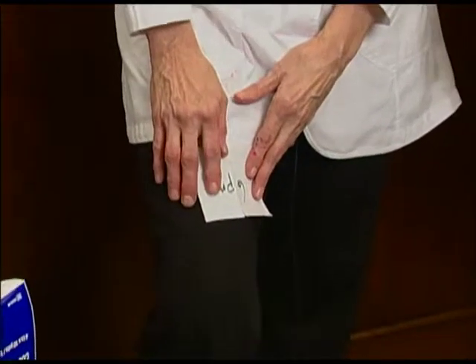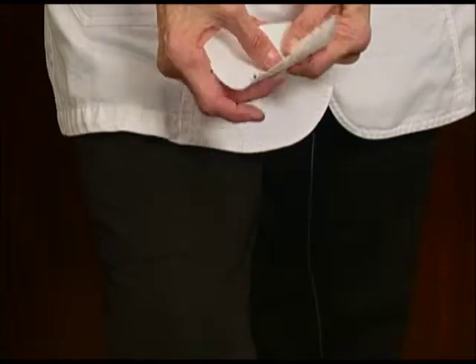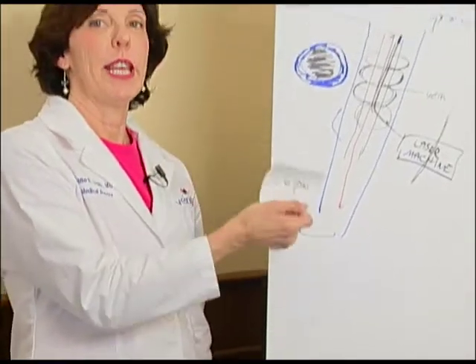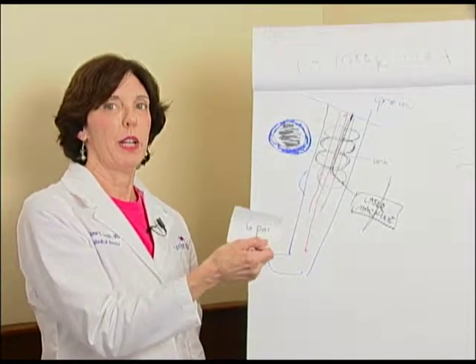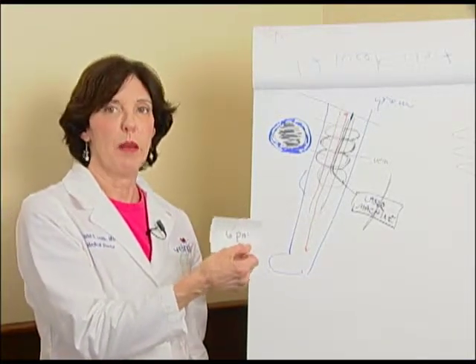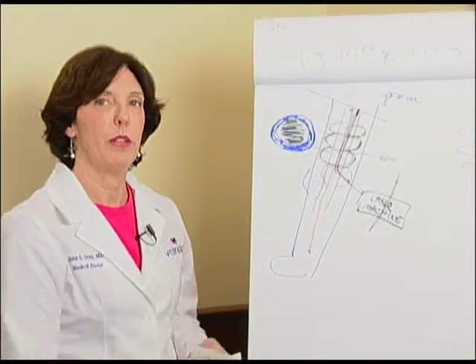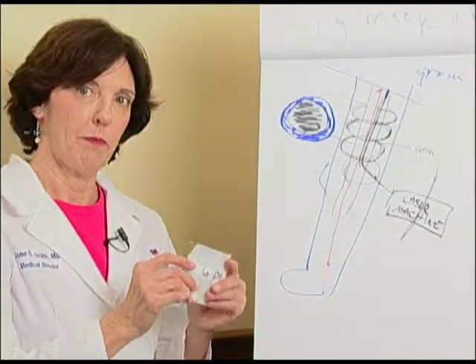There's very little bleeding, as you might imagine, since we put a bunch of fluid here, that some of the fluid may seep out, although it usually doesn't. Now, it's very important that you take this off when we tell you to. A lot of people think if they leave it on overnight that it actually will work better. Well, it doesn't. You don't need it. If there's any sort of fluid coming out, put a Band-Aid on. But we have many people who leave it on and then they end up with irritation around it. So take this off when we tell you to, okay?